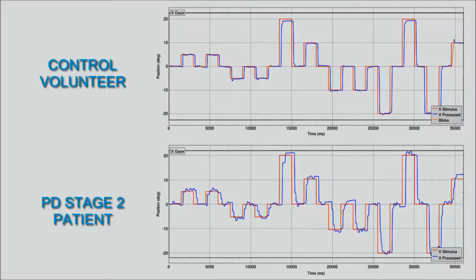The fixations of the patient diagnosed with Parkinson's contain several involuntary eye movements, called square wave jerks. Also, reaction and gaze settling time are bigger. The healthy patient takes considerably less time to reach the stimulus.